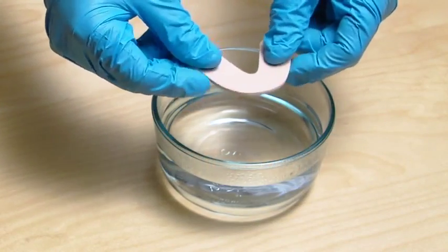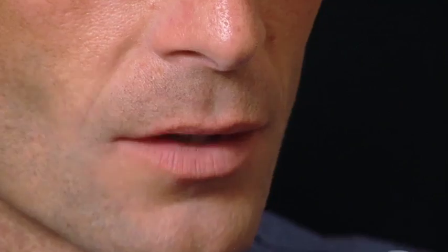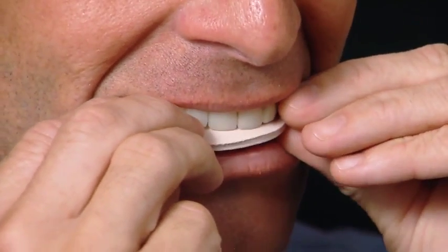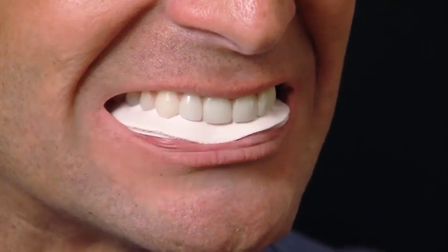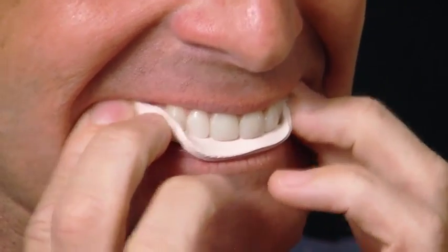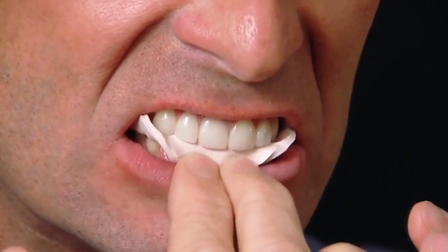Place the AM aligner in boiling water for 1 minute where it will turn soft and flexible. Place the AM aligner in the mouth over the upper teeth. Bite down very firmly. While biting, push the sides of the tray up over the upper teeth and the front of the tray downward so that the material covers the lower middle teeth. Let the aligner cool in the mouth for 5 minutes.